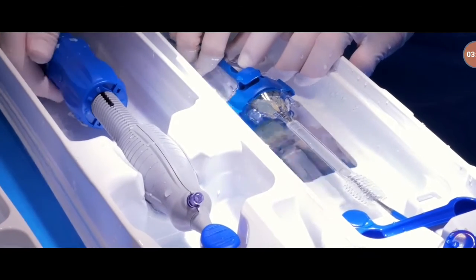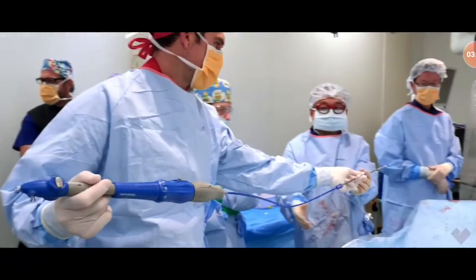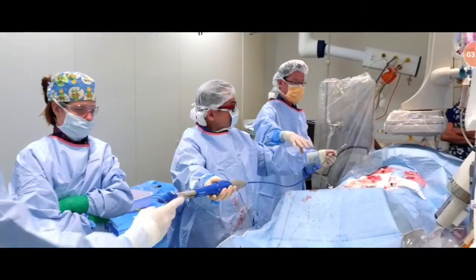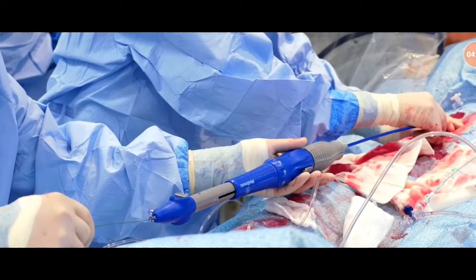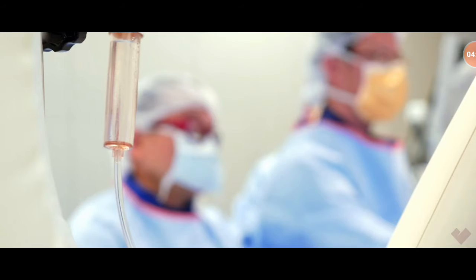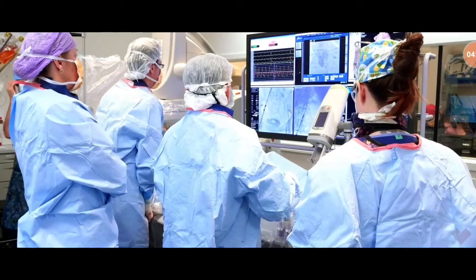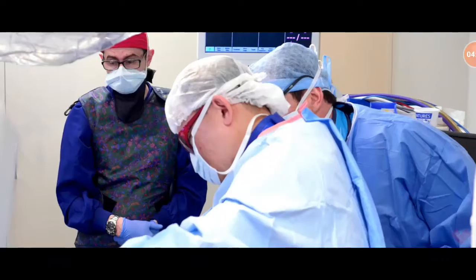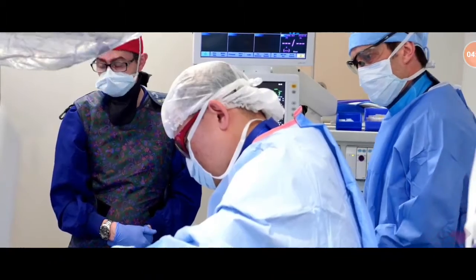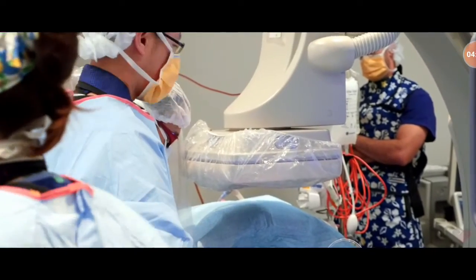The way the procedure works, basically it involves passing a valve which is already pre-mounted onto a delivery system, and it enters through the femoral artery or through a small cut in the chest, and we cross the diseased valve and deploy the new valve there. The procedure is done without bypass, so that means that the heart is still pumping, and once the procedure is completed, the patient can go to the ward the same day without having to go to intensive care.